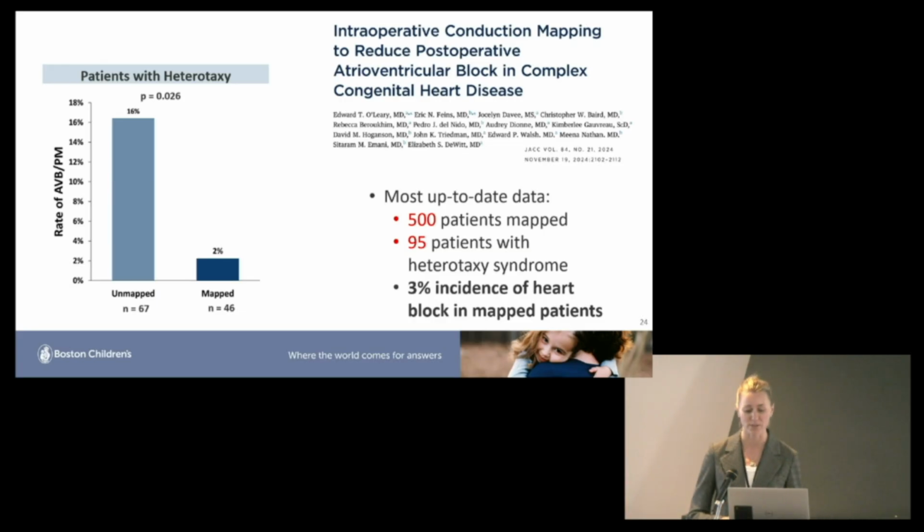95 of those patients have had heterotaxy syndrome, and only 3%, which is actually 3 patients, have had the complication of post-op heart block since we've instituted mapping. So it's been incredibly gratifying. It's always a bummer because I don't get to meet the patients because they don't need a pacemaker, and so I don't need to talk to the family. But very happy to have it that way and to intervene on the front side of things rather than being in the operating room putting the pacemaker in with the surgeons afterwards.